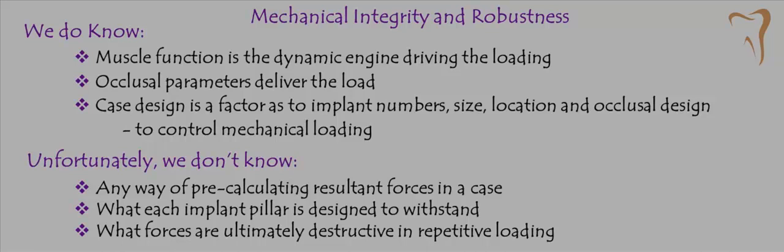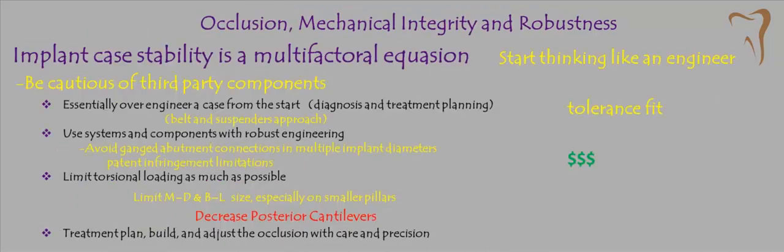Unfortunately, what we don't know in these situations is there's no way of pre-calculating the resultant forces in any particular case. And what each implant pillar is designed to withstand, we don't have all that data either. And even if we did, how would you match it up into the particular case? And what forces are ultimately destructive in repetitive loading? That's another whole aspect. So how do you deal with all this?